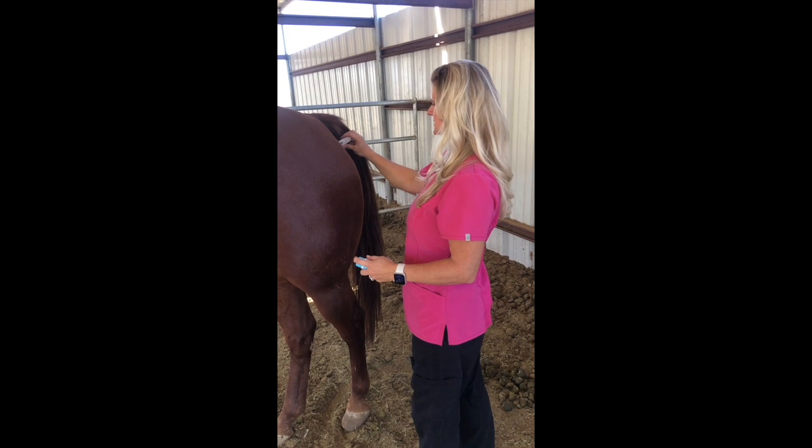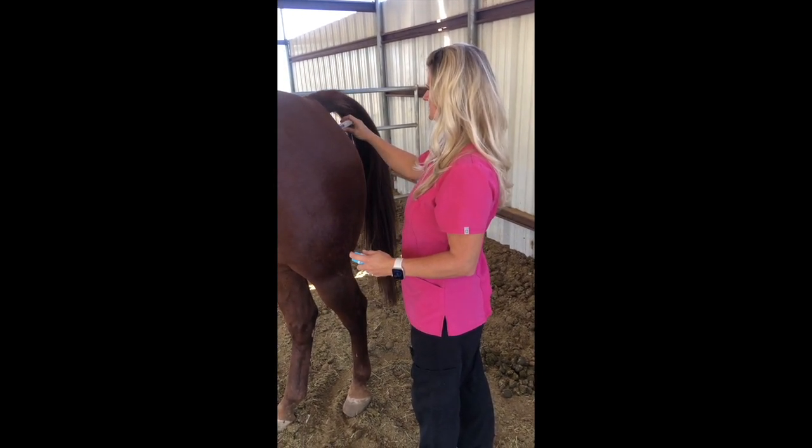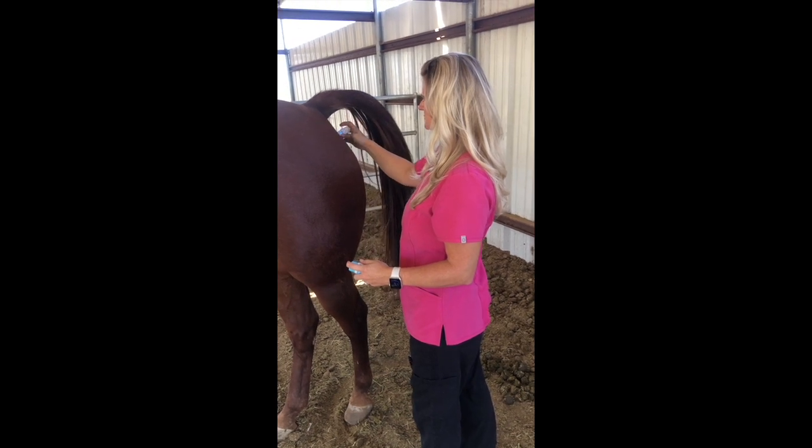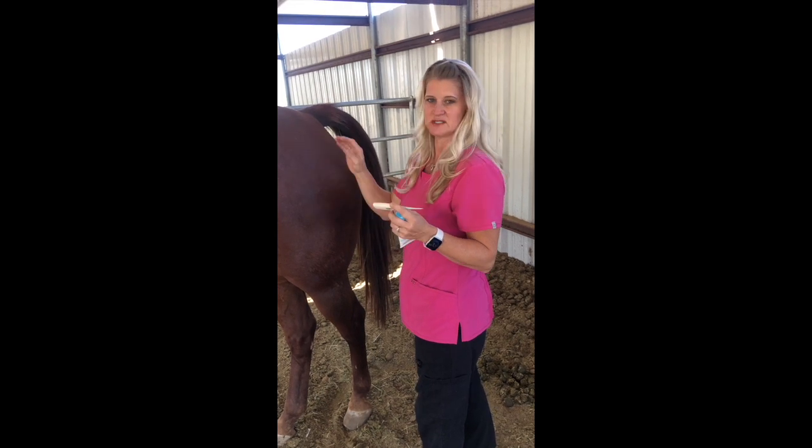And then it takes about a minute and it'll beep. And she's normal.